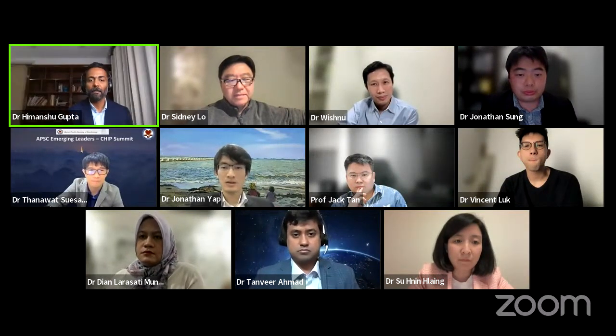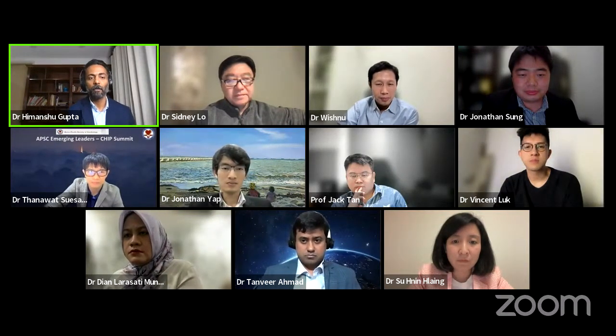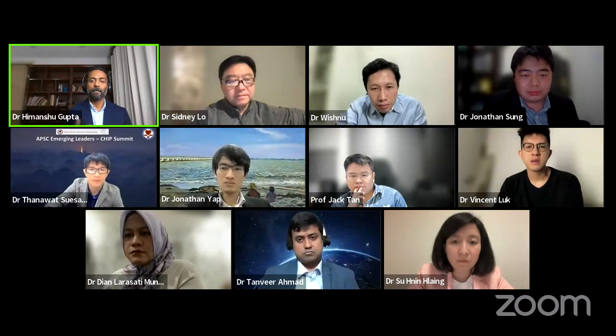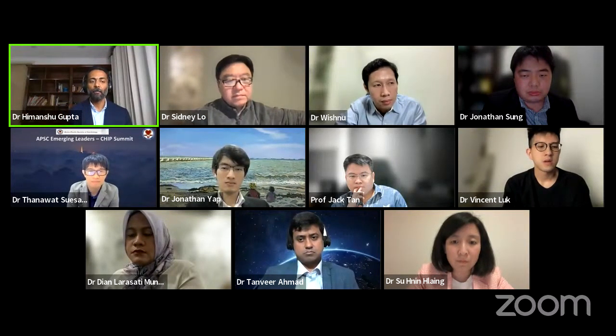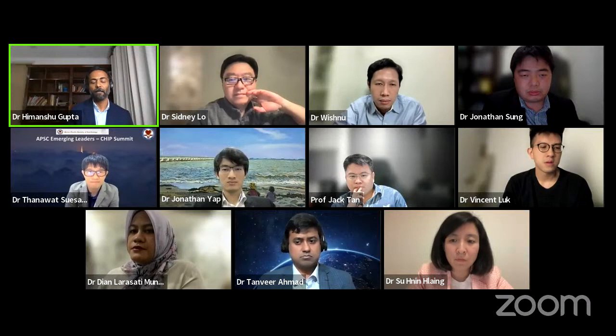Jonathan, can I ask a question? Please go ahead. To many people who've used a lot of orbital, unlike us, do you think there is a difference of differential cutting between the orbital and the rotablator device? Because in the rotablator device, differential cutting is directly proportional to speed. So the higher the speed, the more the differential cutting; the lower the speed, the less the differential cutting. So it cuts normal tissue at very slow speed because the burr wobbles. Whereas in the orbital, more dissections happen at higher speed, and fewer dissections at lower speed. So do you think there is a difference in how the two devices have differential cutting effect?